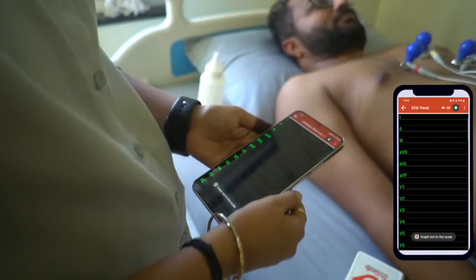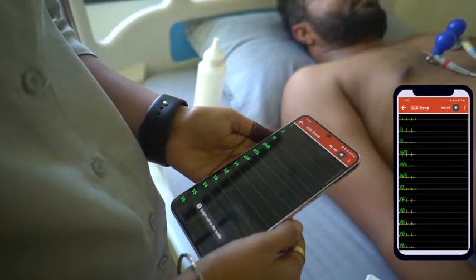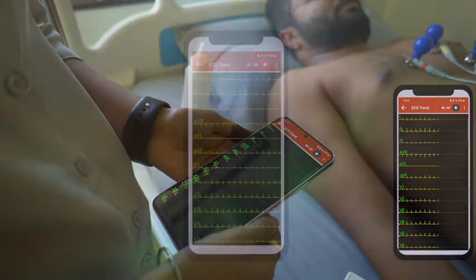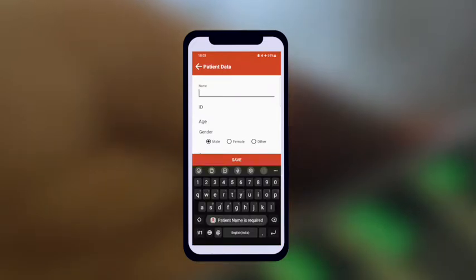Ensure that the patient is relaxed and does not strain their muscles. Ask them not to move or talk during the first 20 seconds. After 20 seconds, stop the recording and click on the tick button, which is next to the stop button.